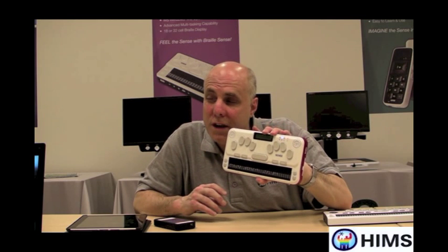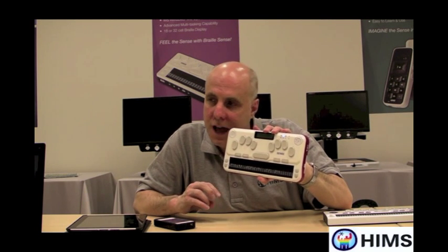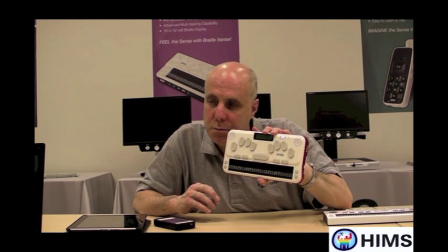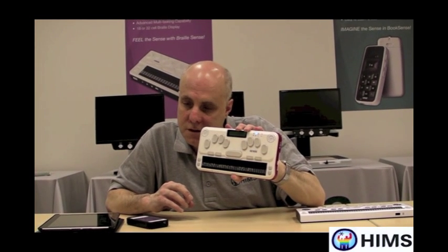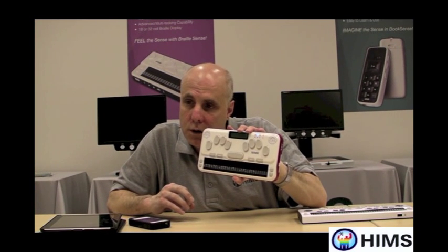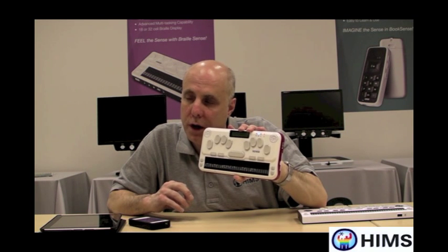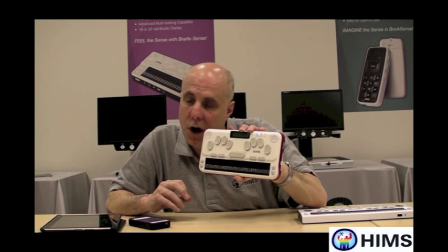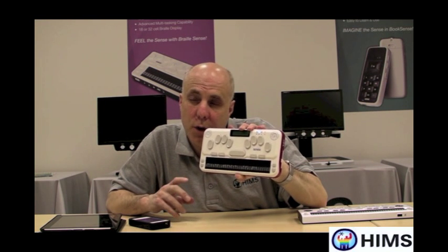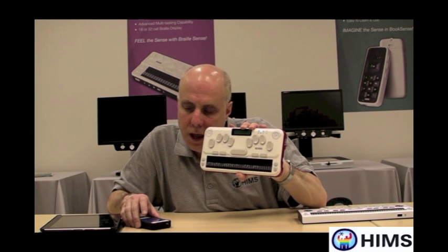So I could write the word 'the' as dots 2, 3, 4, 6, hit space, and immediately 'the' shows up on the iPhone as T-H-E. So someone who's learning Braille, maybe who wants to learn grade 2 Braille, can start with grade 1 Braille and as time goes on just automatically transition into grade 2 Braille, and that Braille will be converted perfectly on the iPhone end.